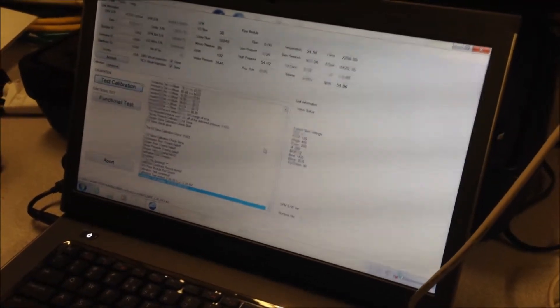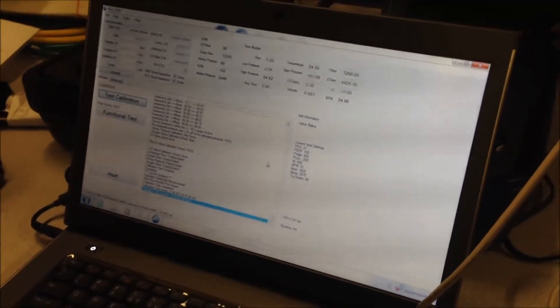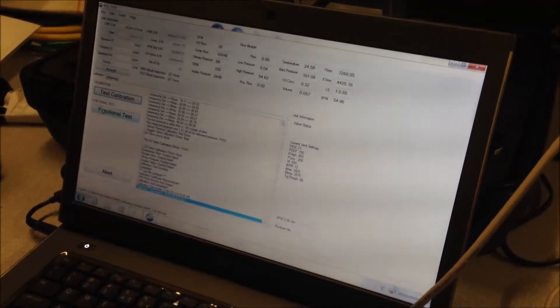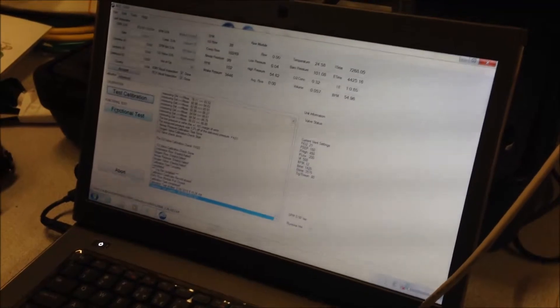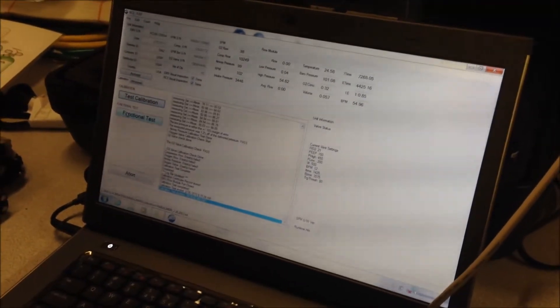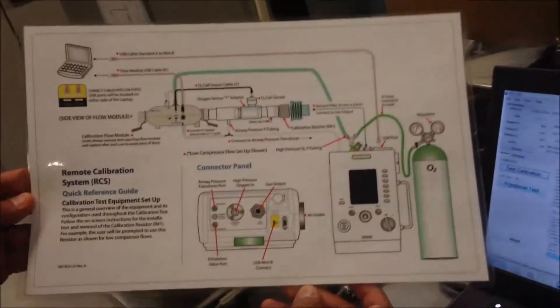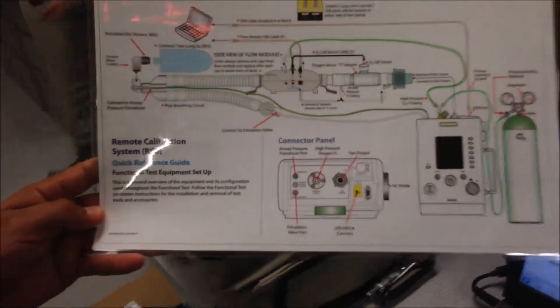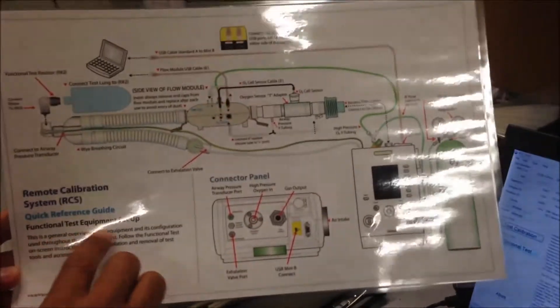The record is now stored into the system and you are going to want to continue the test by performing the functional test. Prior to performing the functional test, you have to change your test setup. Go up over on the quick reference guide and make sure to set up the system to the functional test equipment setup.